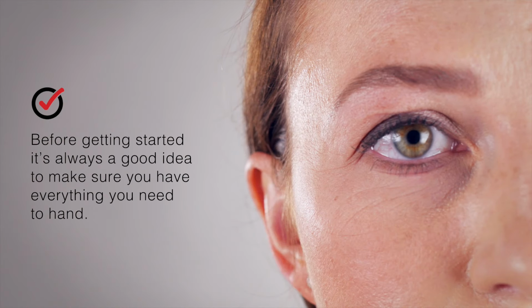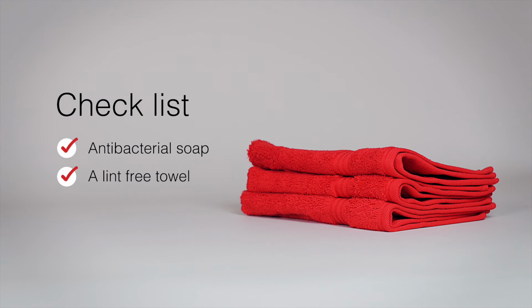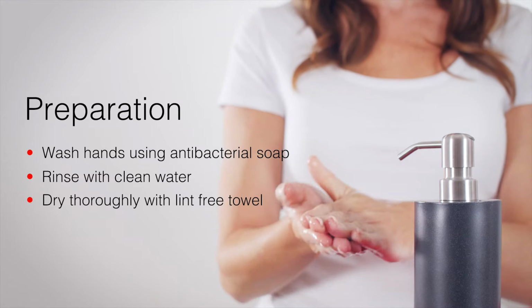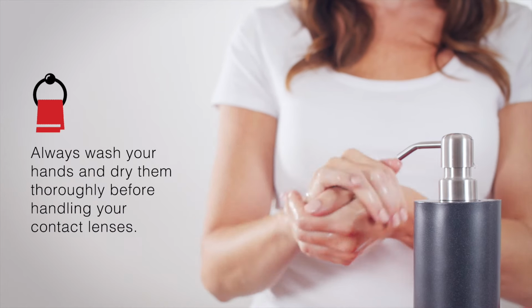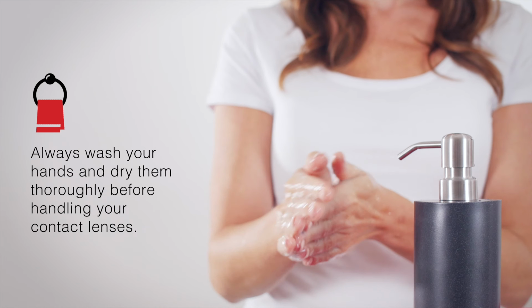Before getting started, it's always a good idea to make sure you have everything you need to hand. You'll need antibacterial soap, a lint-free towel, and a well-lit mirror. Using the antibacterial soap, wash your hands. Dry them thoroughly with a lint-free towel before handling your contact lenses.